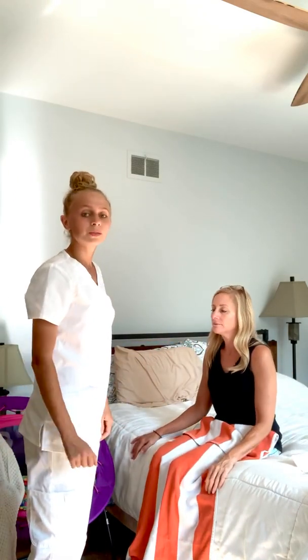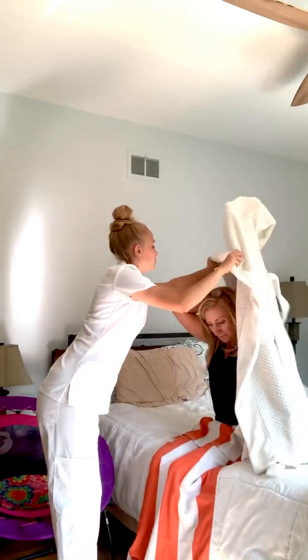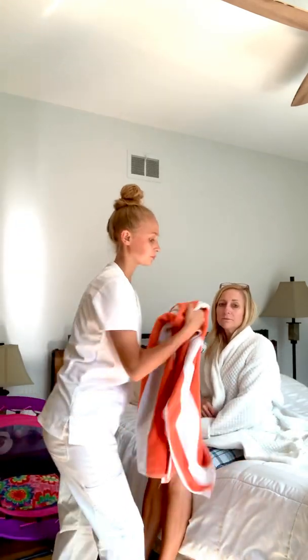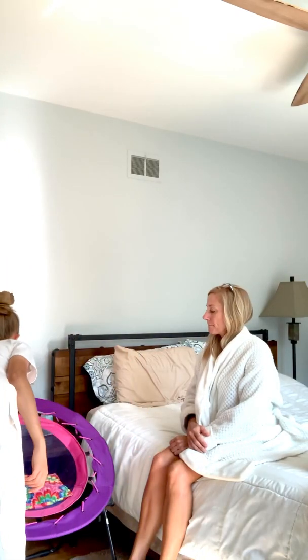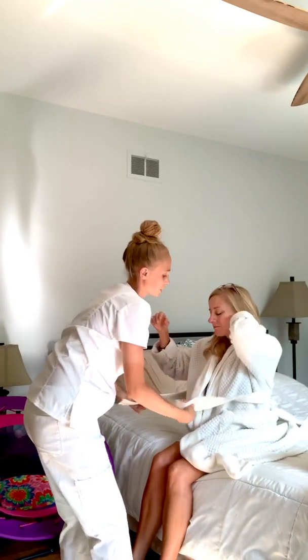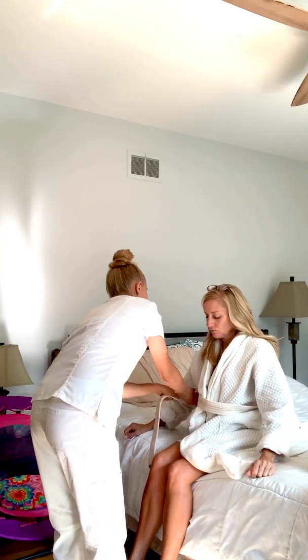And now I am going to be putting on my patient's robe. So after my patient's robe is on, now I can take off my patient's bath blanket. And now I'm going to be applying the transfer belt. So when you apply this, you want it off-centered and you want it to fit snug. You want it to fit about 2 fingers underneath it.